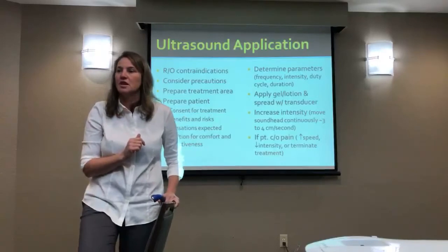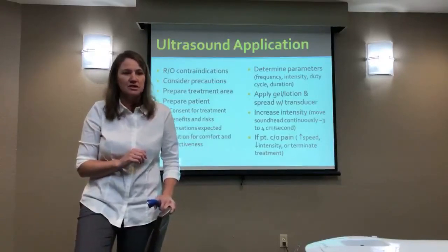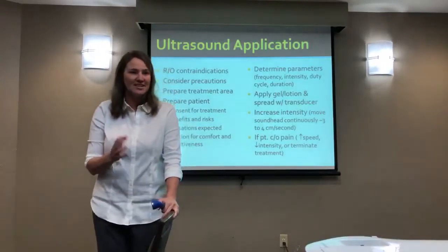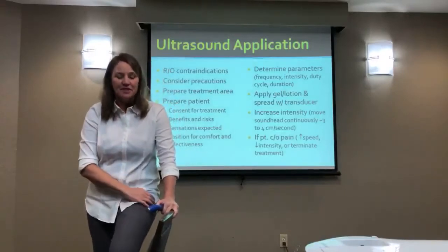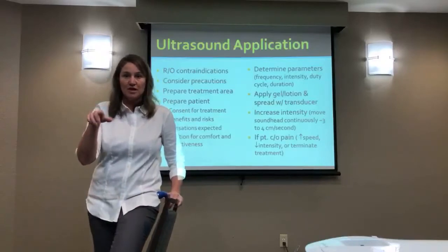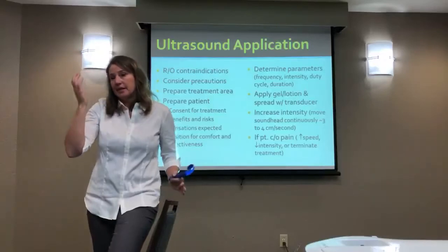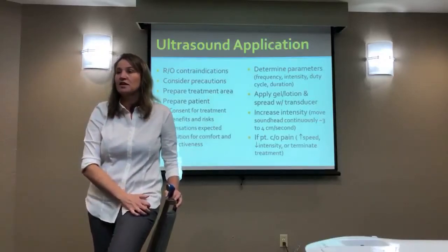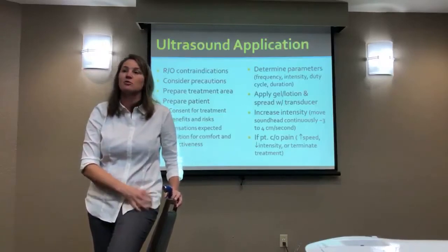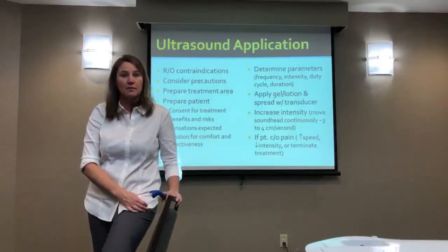Get to know your equipment first. I know our lives are busy. I know a lot of us are under these kind of ridiculous productivity requirements, and I'm sorry for that, but we still have to do things right and safely. If there is a machine that can be preset, and it literally can say room 222, and you set it up the way you want it for room 222, it's going to make you be able to be faster in front of the patient, which, again, defies billing standards, but it still would make you look better and feel more confident, and then you can pay attention to what you're doing rather than trying to remember how to set up the machine.